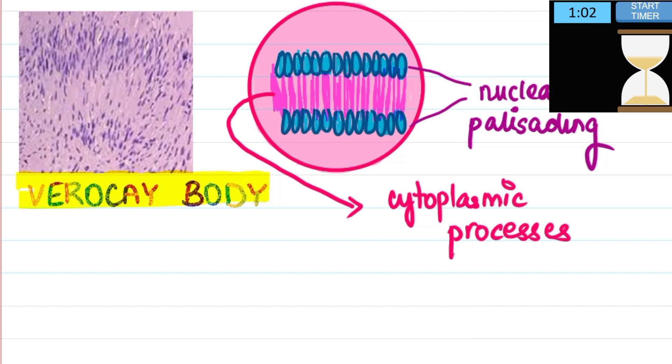Please try to correlate this with the actual image. Two rows of nuclear palisading and cytoplasmic processes in between.